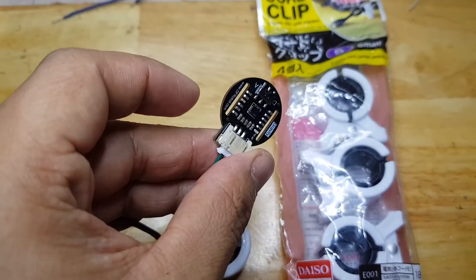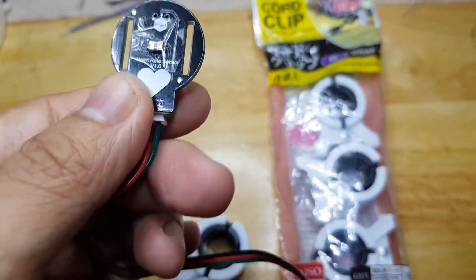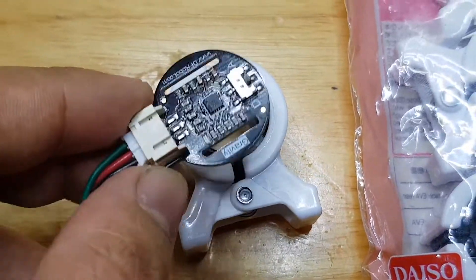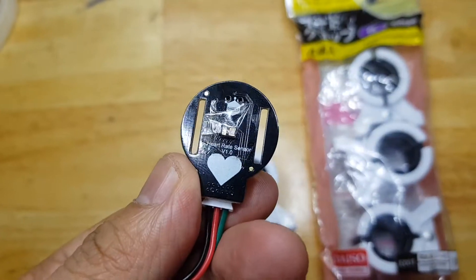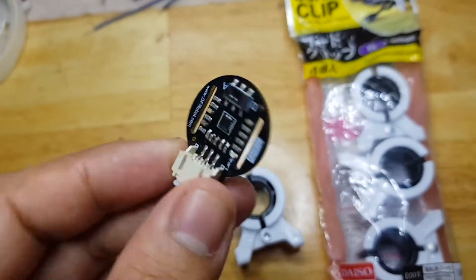What I need to do here is to remove these two sides, because they will not fit here on this cord clip. So I need to cut this, and if you look at the side, it's just pure ground plane. So I don't think there will be any problem. So let's do that.